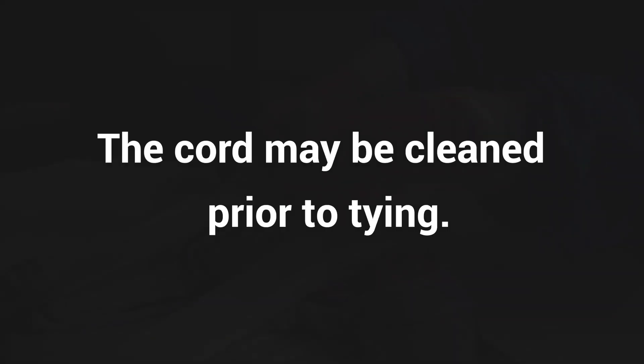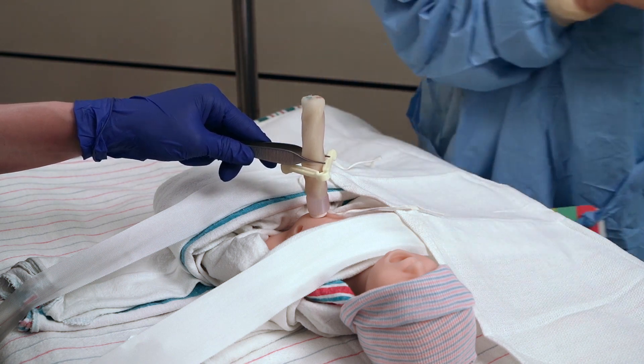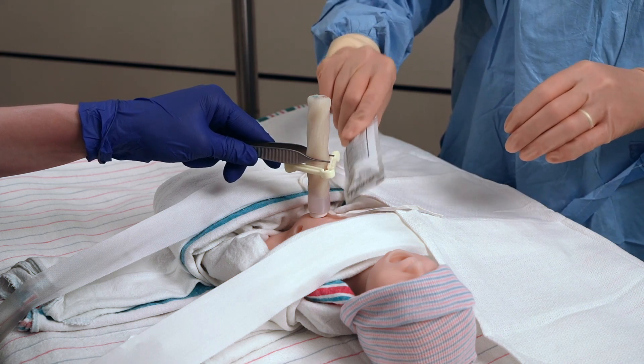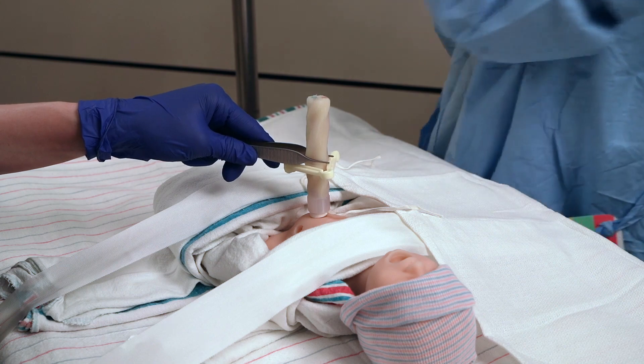The cord will be tied, cleaned, and trimmed. The umbilical tie will be tied loosely and can be tightened if there is excess bleeding. Be sure the tie is not compromising skin perfusion if it is placed around the skin. Hold the umbilical cord upward with a hemostat or forceps using gentle traction while the cord is being prepped with betadine.